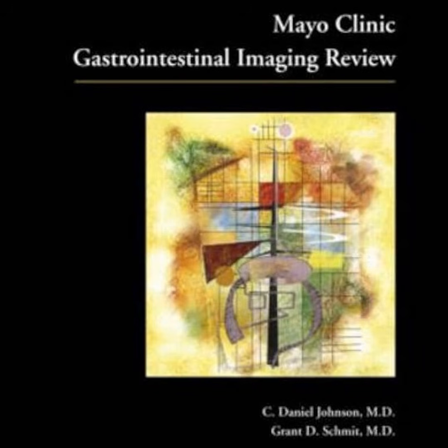And the text highlights this notorious optical illusion in the stomach called pseudo-thickening. To me, the mechanics of it remind me of trying to read the text printed on a dilated balloon. Oh, that's a really good way to picture it. When the balloon is collapsed, the rubber's all bunched up, the writing is distorted and thick, and you can't actually evaluate the surface properly until you blow it up. And if you don't blow up the stomach, so to speak, that bunched up normal tissue, particularly up near the esophagogastric junction in the gastric fundus, looks incredibly suspicious. It mimics a mass, right? Yeah, on a scan, those collapsed mucosal folds can mimic a gastrointestinal stromal tumor or even gastric carcinoma.